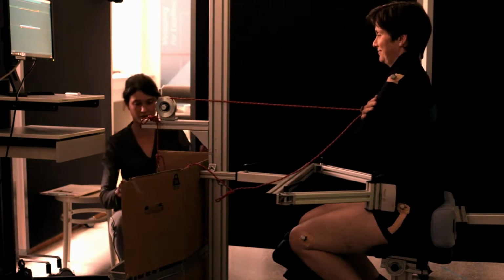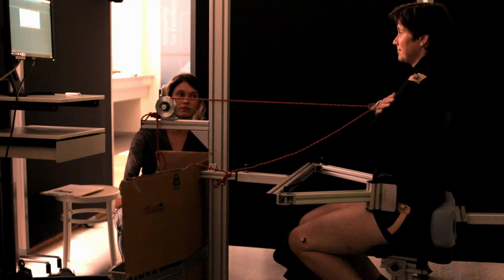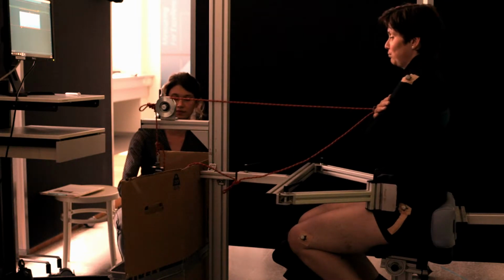Another task we do is a quick force release test. It's the same, that they are sitting in an active position but fixated with their pelvis, and they have a load on their trunk in front or the back. So one of the groups, like the back muscle groups or the belly muscle groups, are working and the others are off, and we release a load and check how the muscles are acting to keep their balance. And we also look there at timing. We use the load cell as a cutoff and see what the timing is of the different muscles.